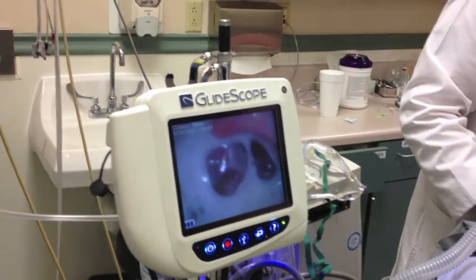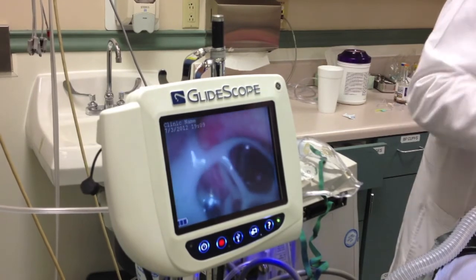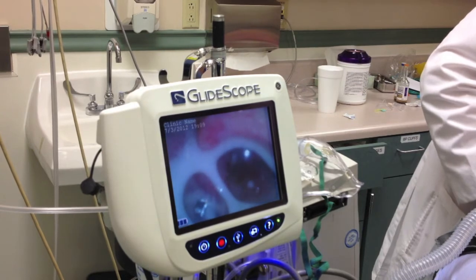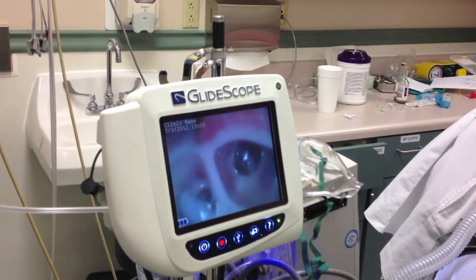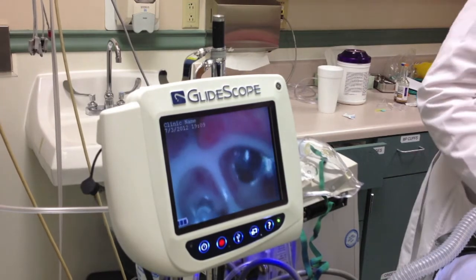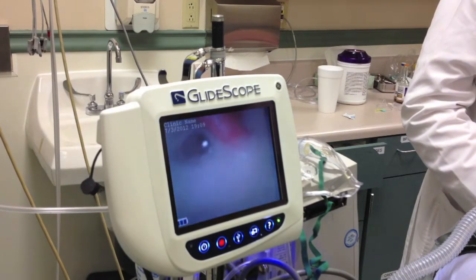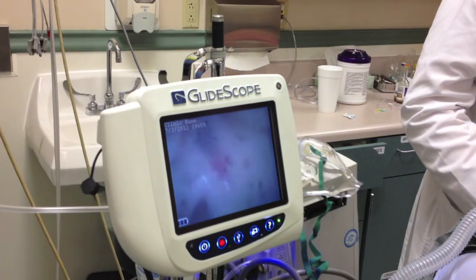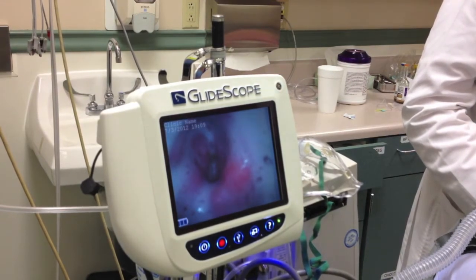As I'm introducing the blade into the patient's throat, you can see there are a lot of secretions — those secretions were just laying there and the patient could potentially aspirate them. I'm trying to reach for my suction catheter, but it wasn't turned on, so I had to have them turn it on. That cost me a few seconds, maybe even half a minute. The secretions were very posterior, so even though I'm suctioning around the tongue area, I wasn't getting to them.